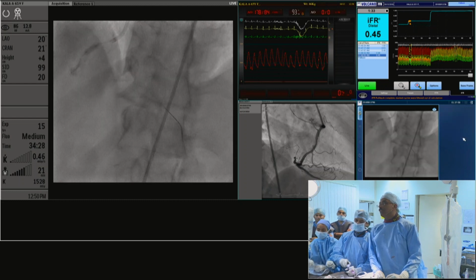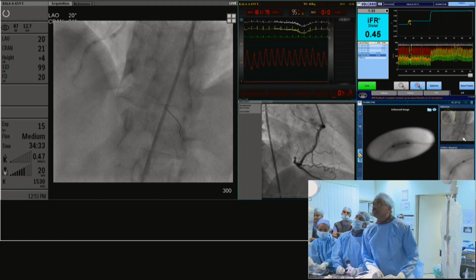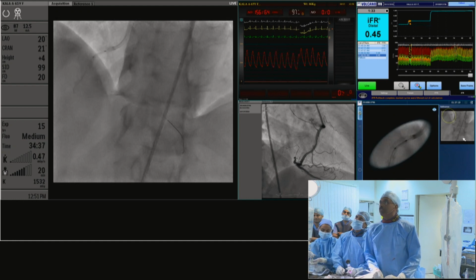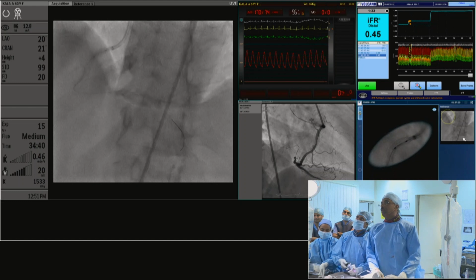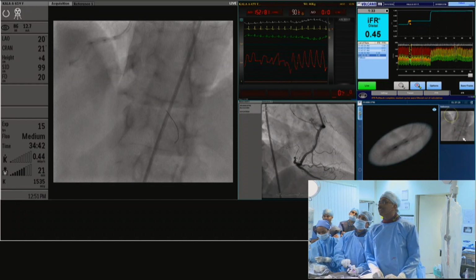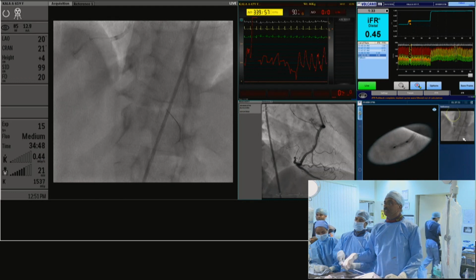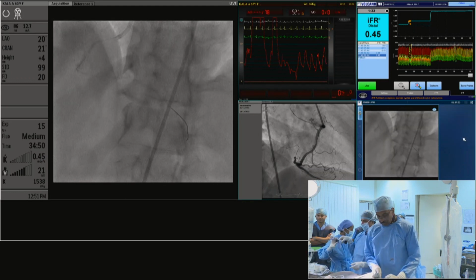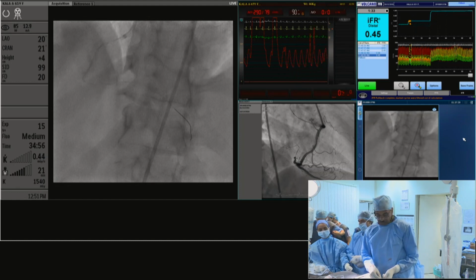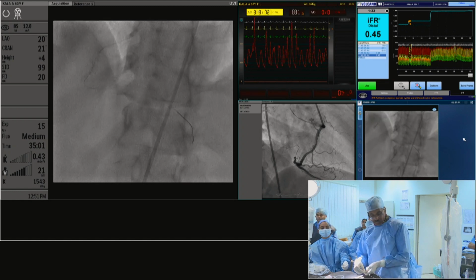I think you raised a very valid point. I raised it earlier that we've used imaging, and it's shown us a lot of good things. But how would we actually handle this patient where an IFR shows us that the mid lesion should not be done? And of course, it's a very unfavorable lesion. It's not just a discrete lesion which shouldn't be done. It's heavily calcified, it could have adverse outcomes while doing it, and it has adverse outcomes in the long run. So more the reason to avoid doing it, which therefore means how do you get your stents downstream, and that's the only reason why this lesion has been touched.